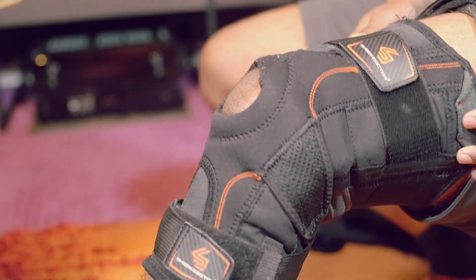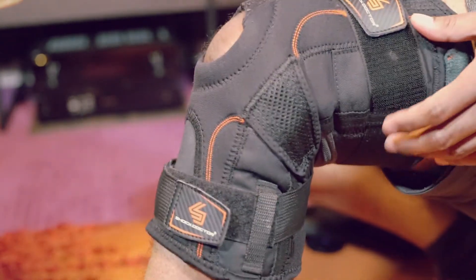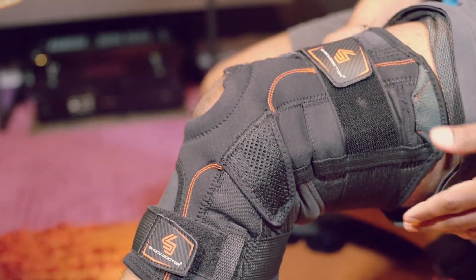I use this brace while playing tennis and it feels great. Most importantly, it stays in place.